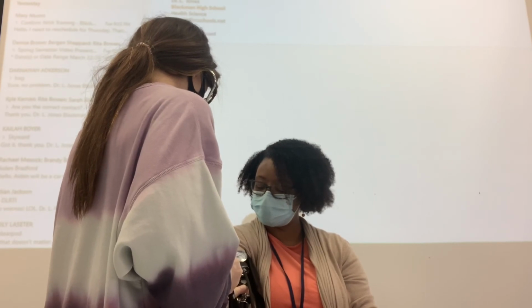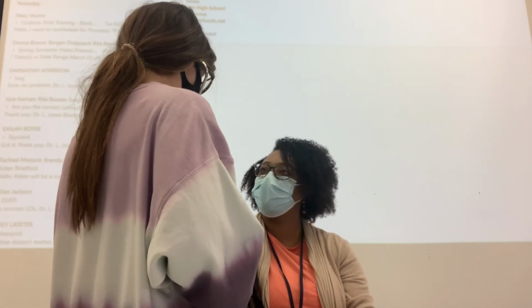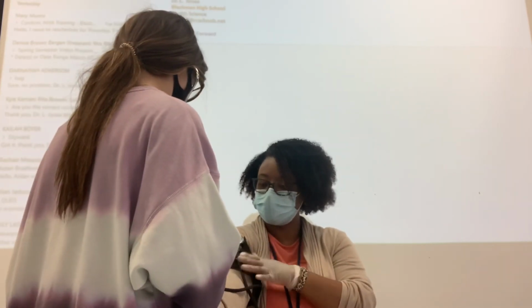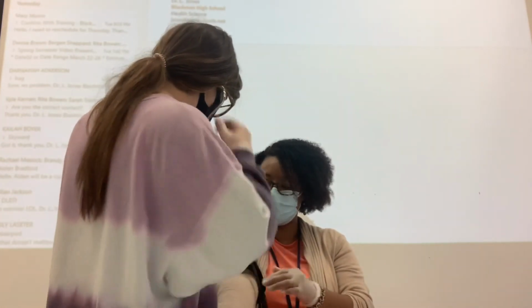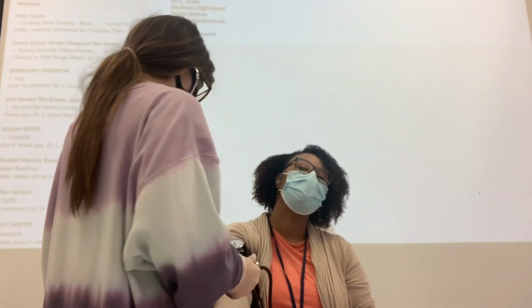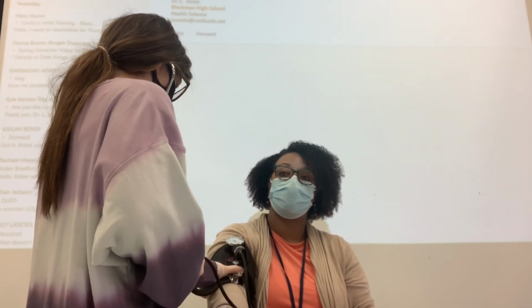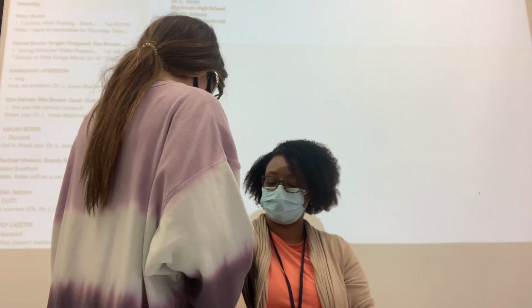Yes, that hurt. This side hurts. Did you hear something the first time? Here, try one more time. So, move your stethoscope over, make sure it's flat. Make sure the bell is flat. Miss Jones, you're supposed to use the big side, the larger side. Use the big side.